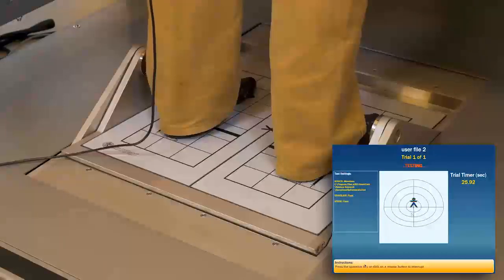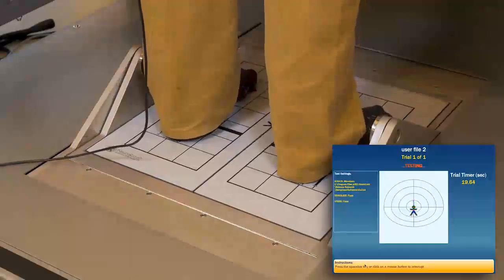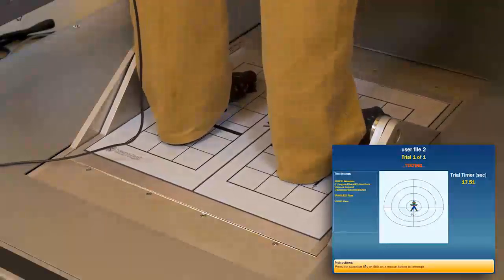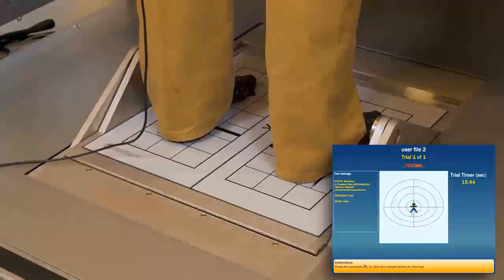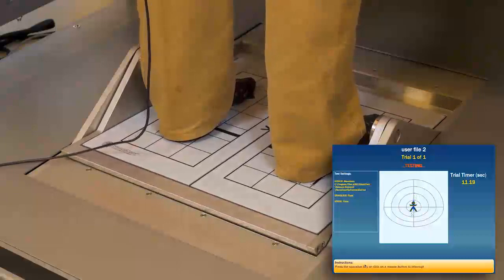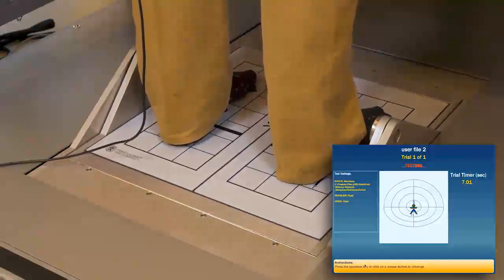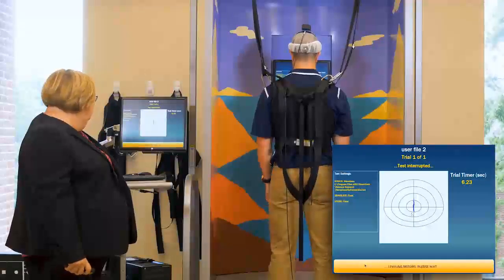So it's hard to tell while he's on it that there's a lot of change. But if you had seen the platform, it looks a little smoother at this point. And I'll show you when we get to the motors that it's smoothed out. So let me go ahead and stop it again.